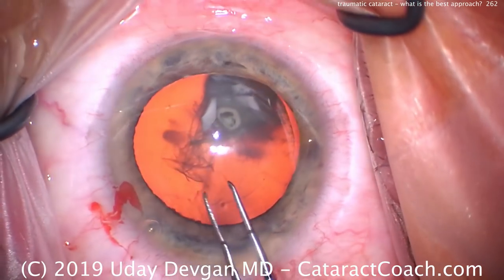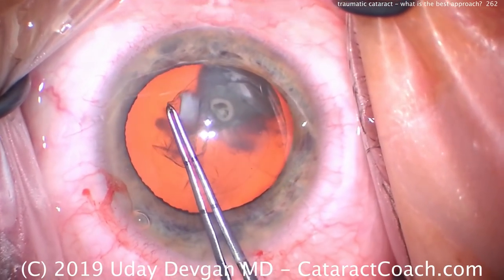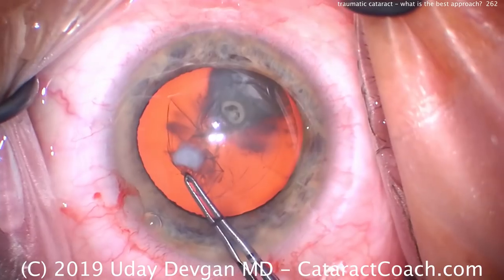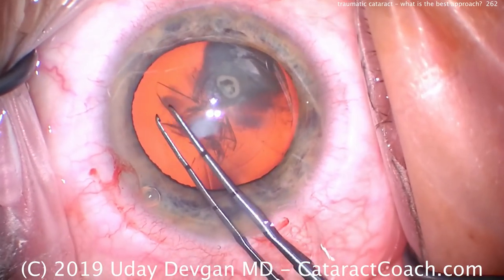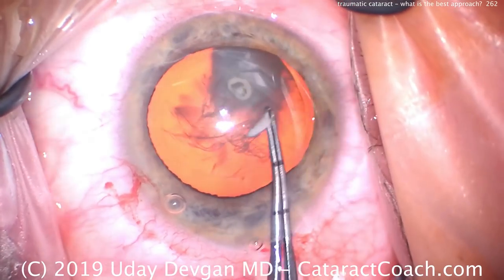There we encompass that fibrous plaque, and I have the capsule where I can see it, and now we can finish. Very important to encompass that fibrous plaque. You see, we've peeled it right off. It's stuck to the anterior lens capsule.